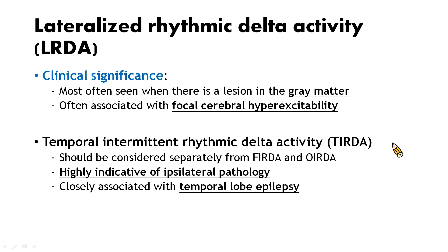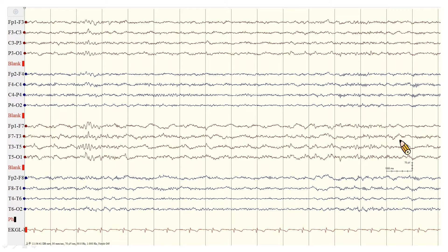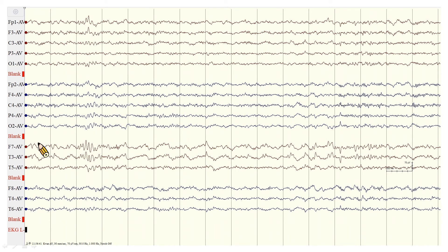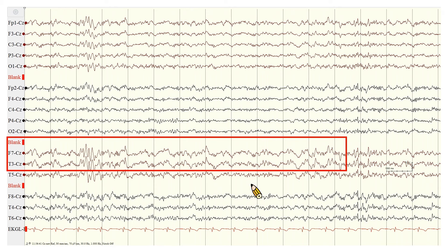Then we talk about lateralized rhythmic delta activity, or LRDA. It is most often seen when there is a lesion in the gray matter and is often associated with focal cerebral hyperexcitability. The most classic example is temporal intermittent rhythmic delta activity (TIRDA), which should be considered separately from FIRDA and OIRDA. It highly indicates ipsilateral pathology and is closely associated with temporal lobe epilepsy. In this double banana montage EEG, we can see rhythmic delta activities over the left frontotemporal region, with phase cancellation at the F7-T3 channel. The rhythmic delta activity becomes more prominent after changing to average montage and CZ montage. This patient has temporal lobe epilepsy.